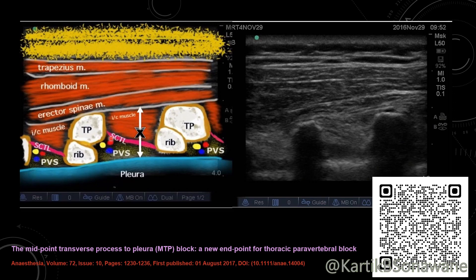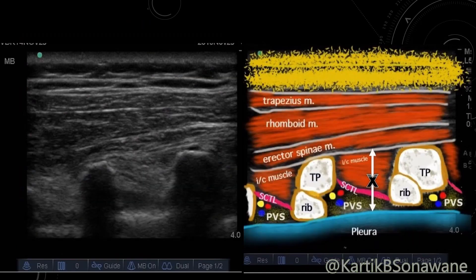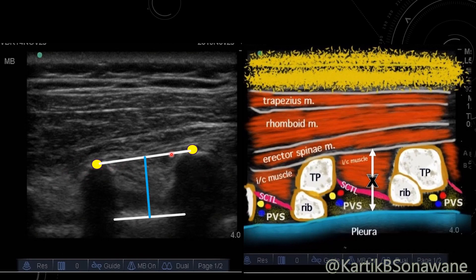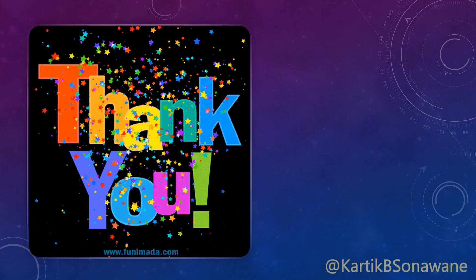After obtaining the sonoanatomy picture, two points are marked representing the tips of adjacent transverse processes and connected by one line. A second line is drawn over the hyperechoic pleural surface, and a third line connects both lines. The midpoint of the third line (marked in blue) is the drug deposition and injection point for the ITP block, which always lies posterior to the superior costo-transverse ligament into the retro-STL tissue complex.